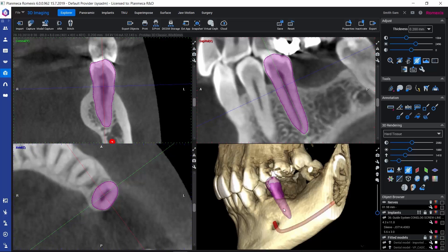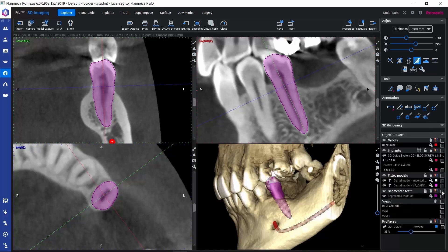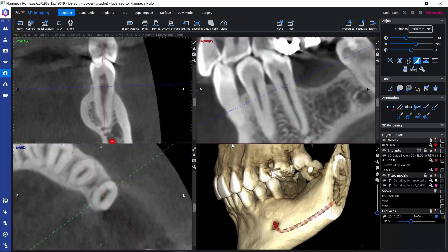Let's see how the segmentation process is done. I will first delete this example tooth that I had segmented earlier, by selecting it in the object browser and using the trash icon to delete it. Then let's restart the process. First it would be good to align the slice views so that we have a good view on the tooth we're going to segment.